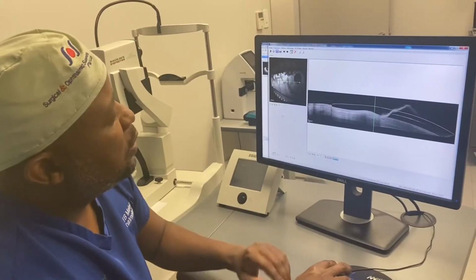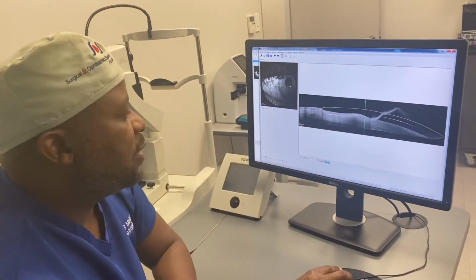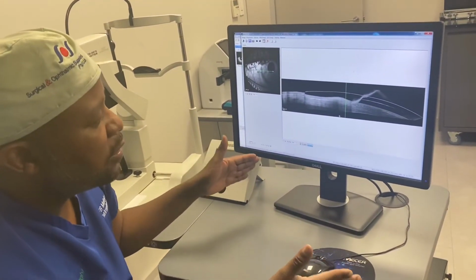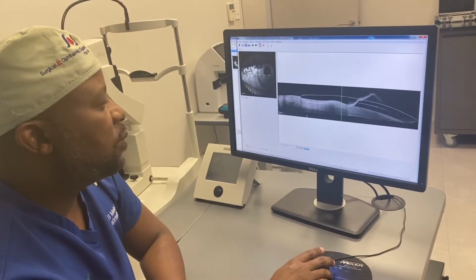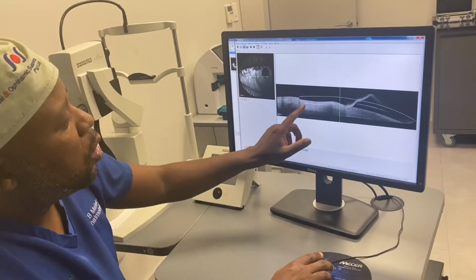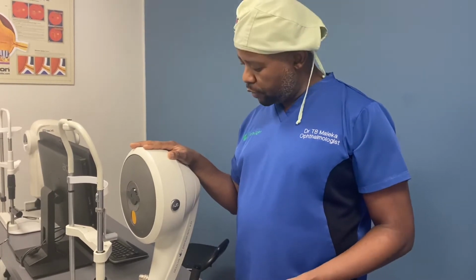With the OCT, you can look at the landing zone of the scleral lenses and make sure that they fit nicely on the patient's sclera, so that the lenses can be as comfortable as they can be, and you can actually do measurements on the OCT itself. You all know a Pentacam and its capabilities. It's used mainly for corneal work, especially keratoconus, to diagnose and follow keratoconus patients.